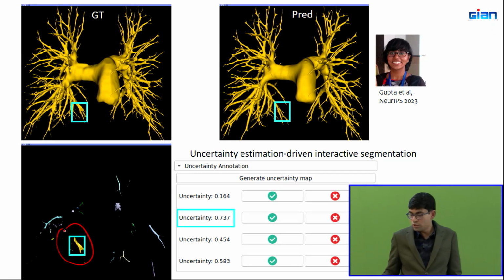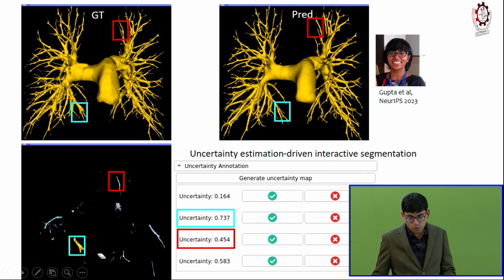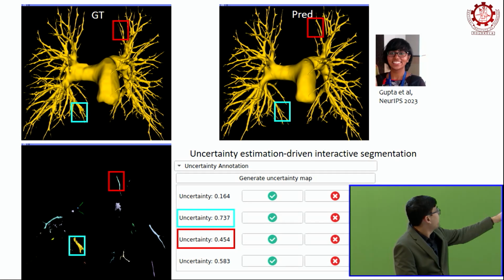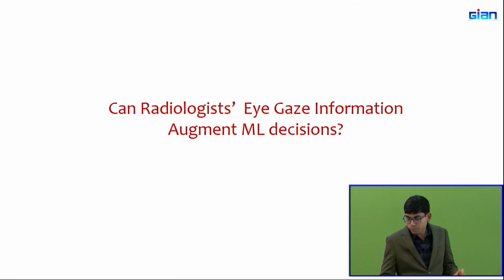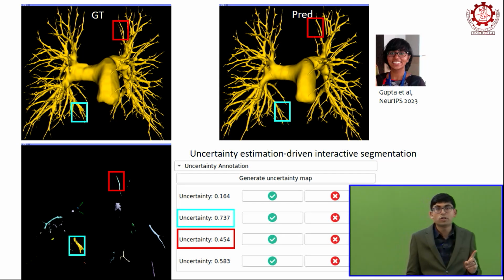It's not just one region. On the ground truth, you see that small filament on the left, and you don't have that filament segmented in the predicted image on the right, and that is what I am showing in the bottom image, that part that was missed out. So, you see that there are these tiny regions that we miss in our segmentation model.